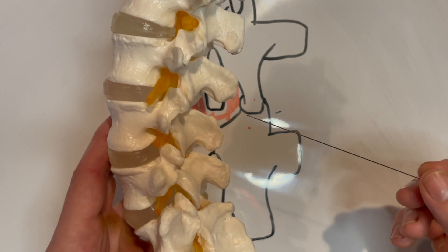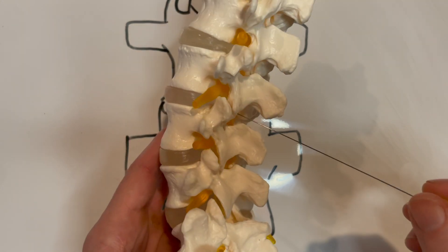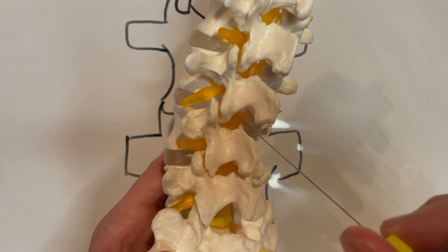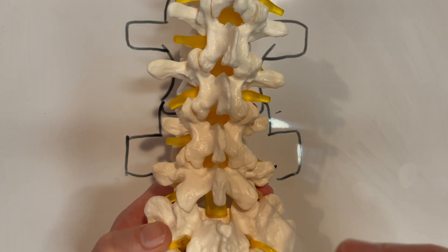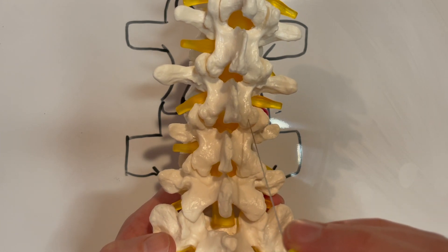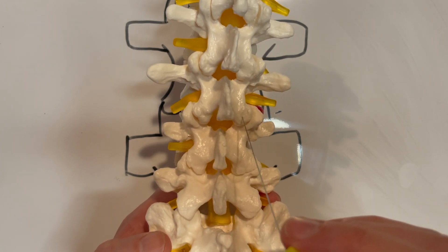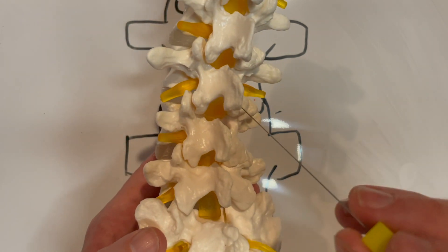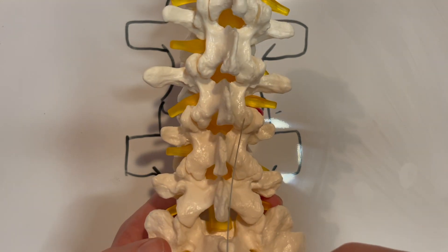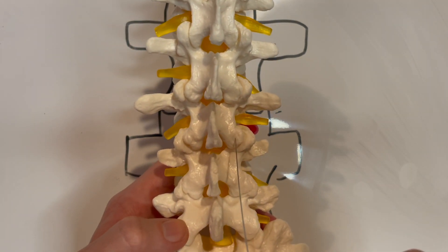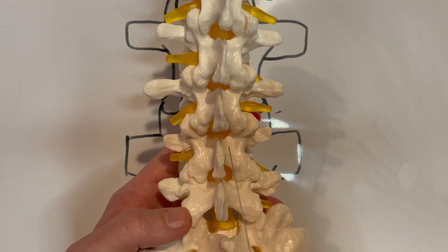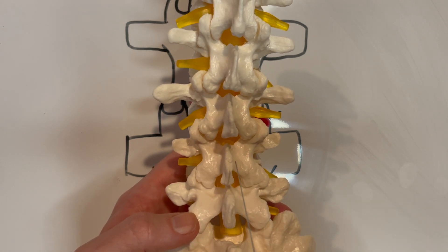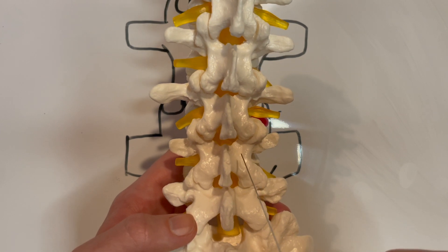And if I were to do just that, I'd be in the right space and I'd be able to get some CSF. And then alternatively, if I started off a little bit to the right and I hit this, what am I hitting now? Well I know I'm pretty far into the skin, I'm several centimeters deep and I'm hitting a process. And then I can palpate my landmarks as well and realize, 'Okay, I'm likely hitting the right inferior articular process.' So if I'm hitting the right, I back up all the way out of my ligaments and then redirect my needle.